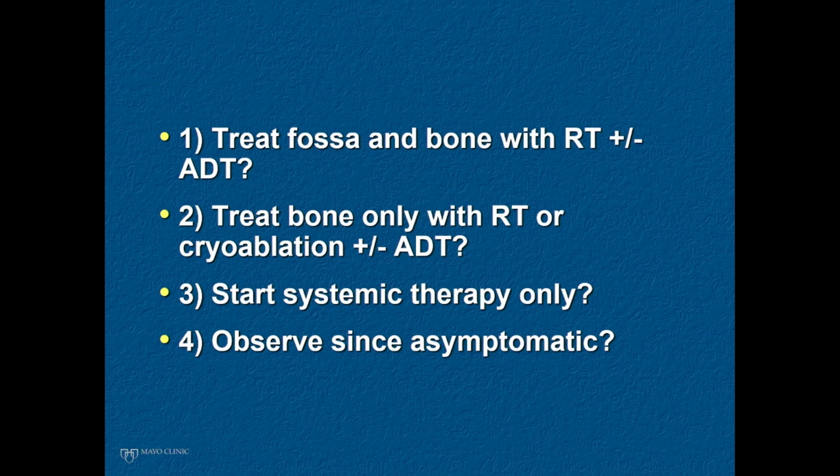So traditionally, patients would have been treated just on systemic therapy, but now we have a single oligometastatic bone lesion. And as a radiation therapist, I don't think we probably have any in the audience, but would you actually treat the fossa because of T3B despite negative imaging and negative margins? So anybody want to speak up, or I'll just tell you what happened.